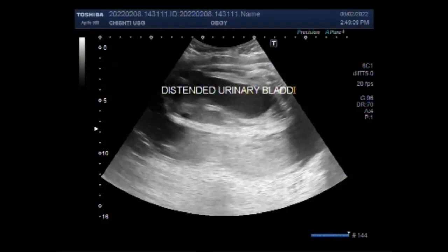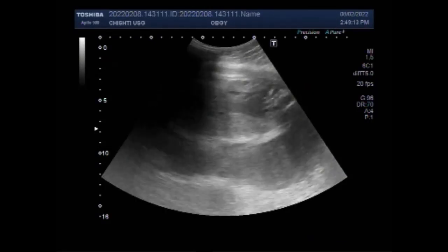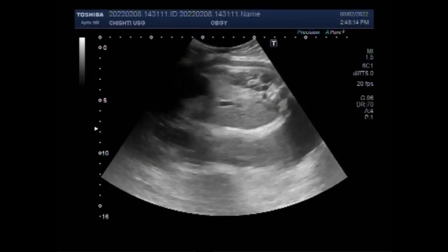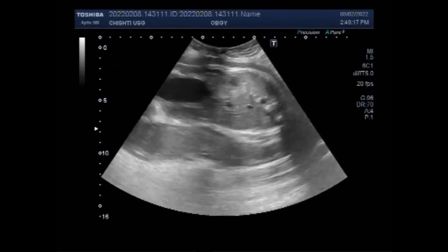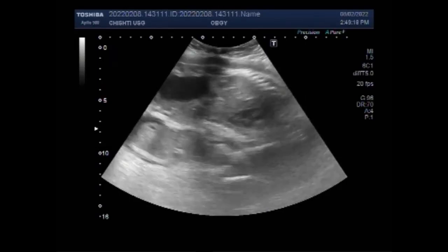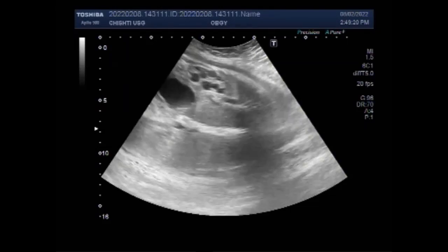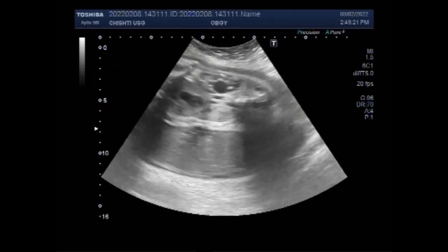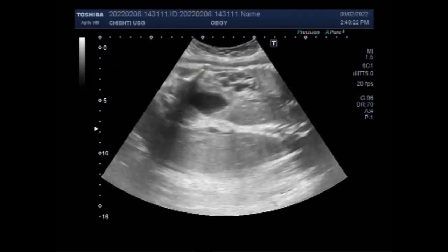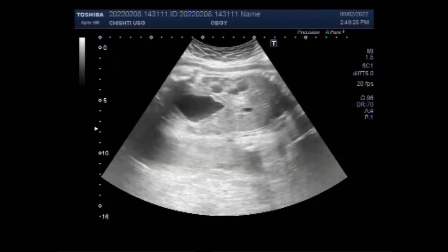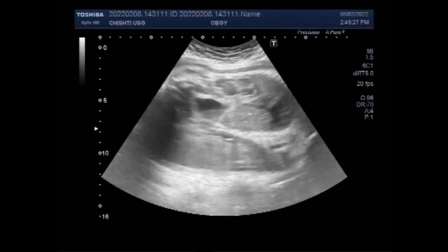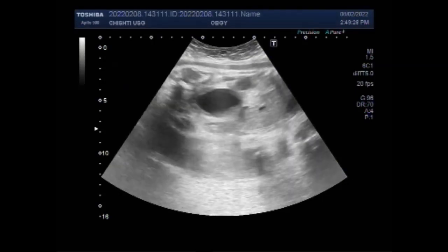You can see the urinary bladder of the fetus is grossly distended due to urinary retention, and this is one reason why there is oligohydramnios in this case. You can see the fetal kidneys and multiple cysts are seen in the fetal kidney.